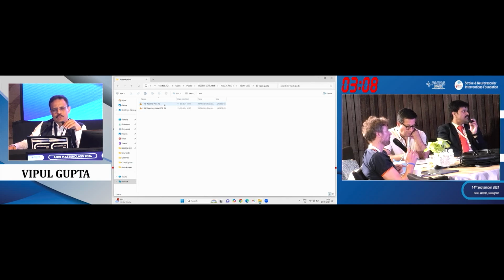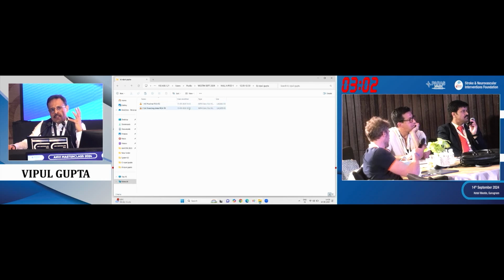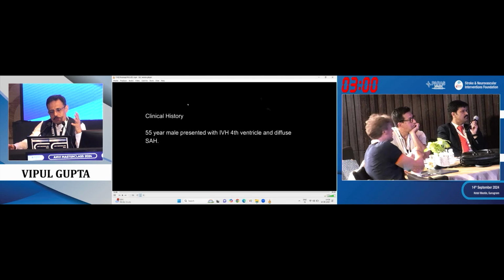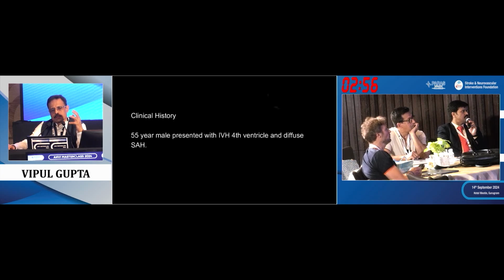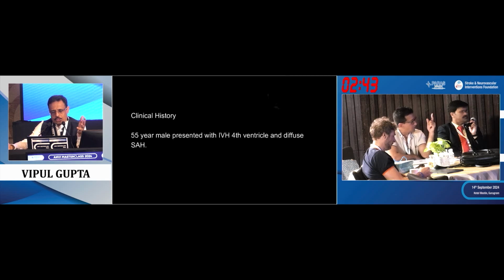I agree. None of us have done, at least I haven't done 100, maybe I've done 40, 50 blisters overall by now in all those years. And we had one bleed. So one would say, yeah, maybe we also have a 2 to 4% rebleed rate. But there is a belief that using a lot of force to compact it and get great apposition really helps in preventing rebleeds and getting away with one flow diverter. But again, I don't know, and Tufel is right. Maybe in the next patient I have a rebleed, I will change my protocol.